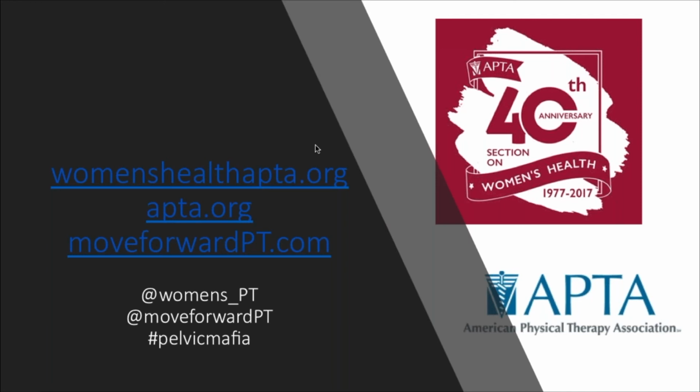The images and the application that we're kind of discussing today, you could err on the lower end because you're not looking for great structural definition as you would for more of a diagnostic ultrasound exam. So you can get away with using a less sensitive unit and it would come at a cheaper price.